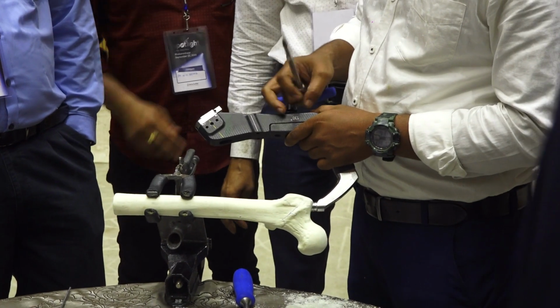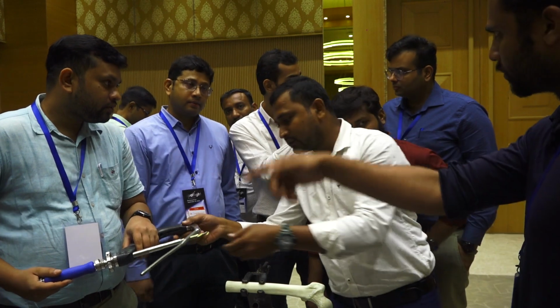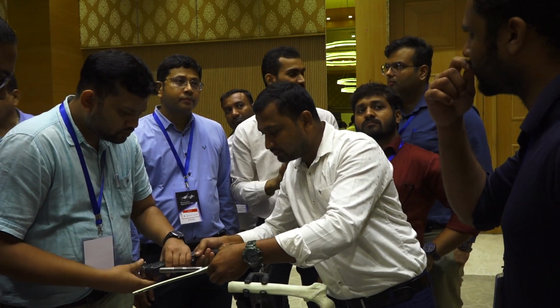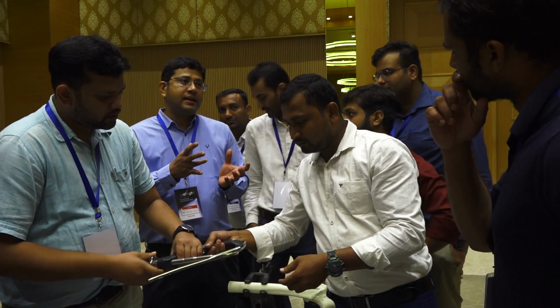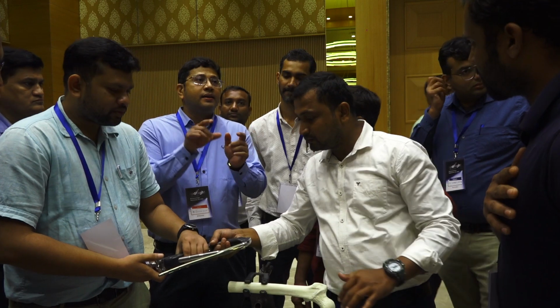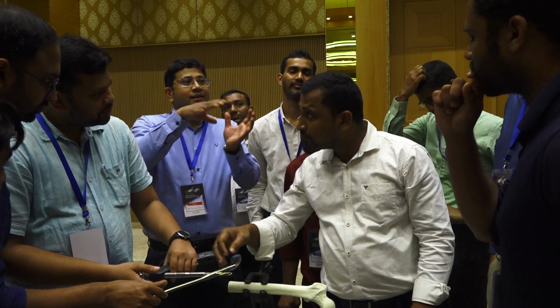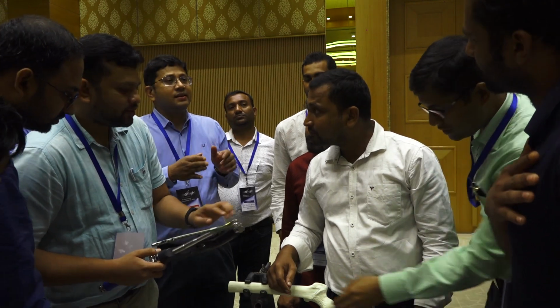Provisionally reduce, then put the helical blade, then put the plate. But if it is a very comminuted fracture, can we use this system there? Yes, you can. Even if it's very comminuted, you can still reduce the posteromedial fragments and lateral fragments, and put them back. You can provisionally fix smaller fragments, and then put encircling wires to keep it together, so that you are very assured of your neck-shaft angle. That is the key to success.